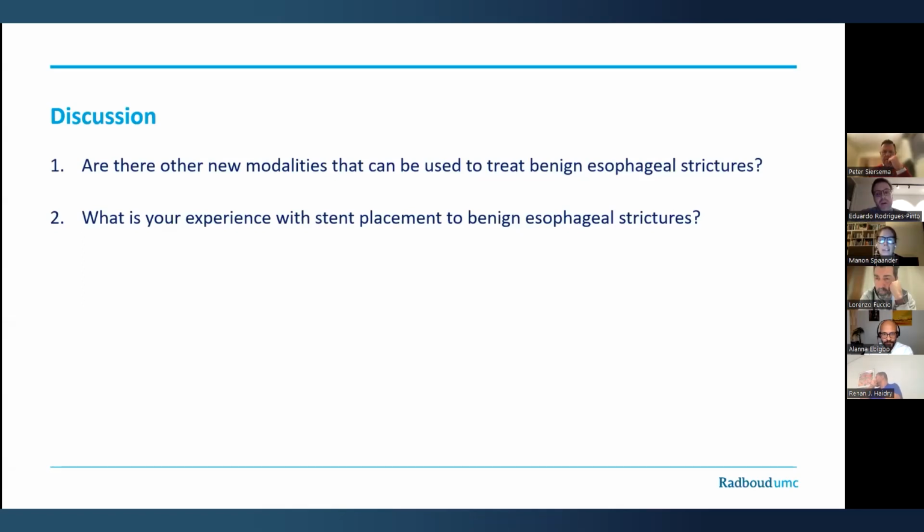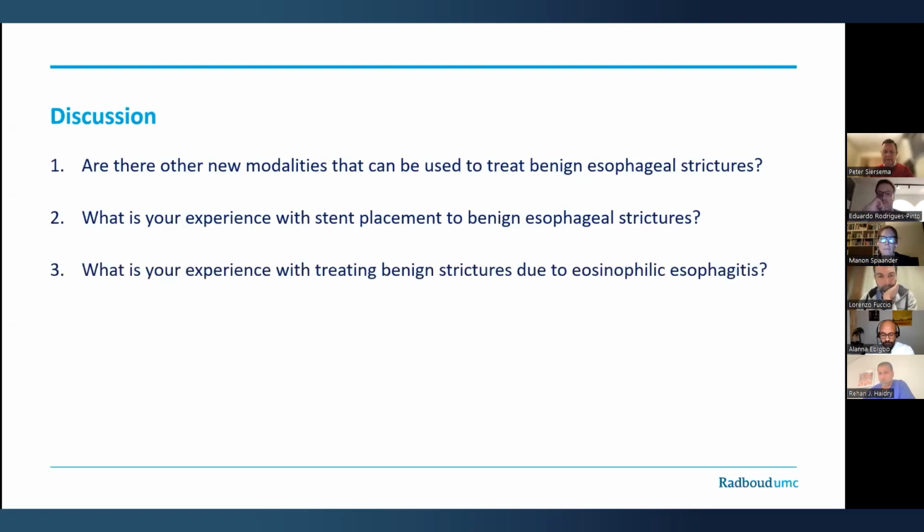But to be honest, most of the time, the dilation treatment is effective, and especially in those cases where we have a radiation-induced stenosis or an ischemic stenosis, it just takes some time and patience to dilate it. And I think with regard to your rule of 3, especially these complex strictures, it is important to take preferably small steps rather than one big step, and take your time and then increase the intervals. Yeah, that makes sense. Yeah, I agree with that.